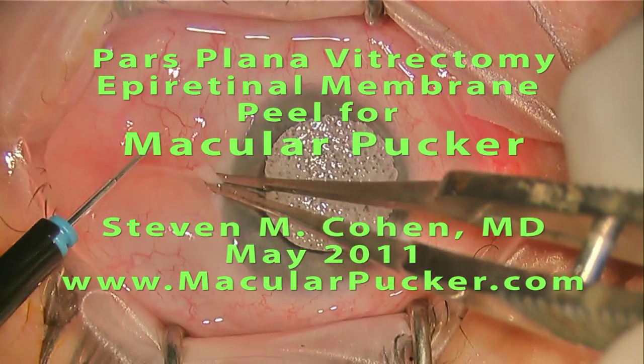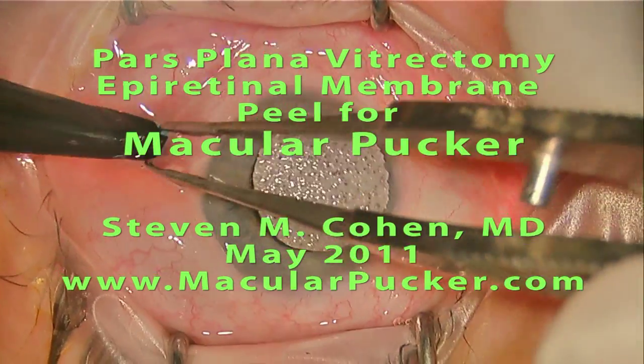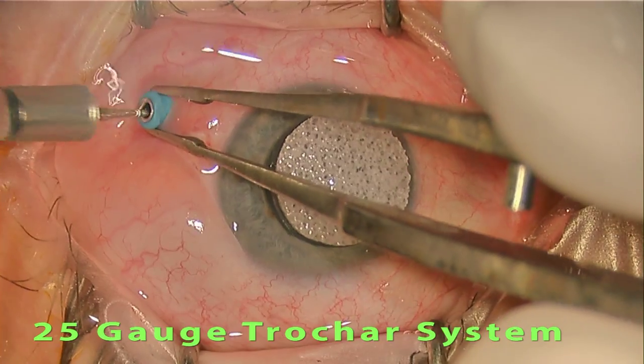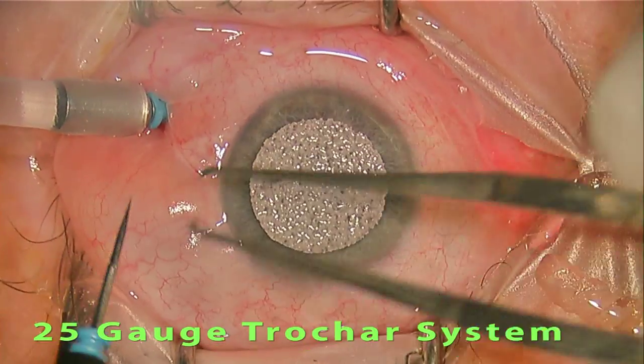Hello, this is Dr. Steven Cohen and this is a high definition video of a vitrectomy surgery for a macular pucker. This surgery is being done with local anesthesia. The patient is sedated and feels no discomfort during the procedure.